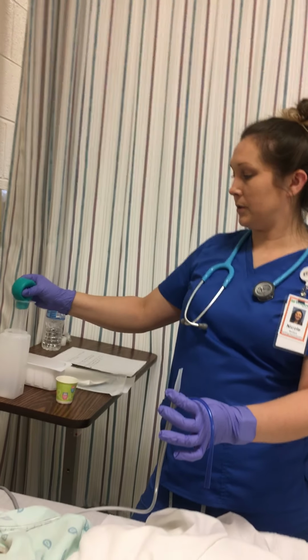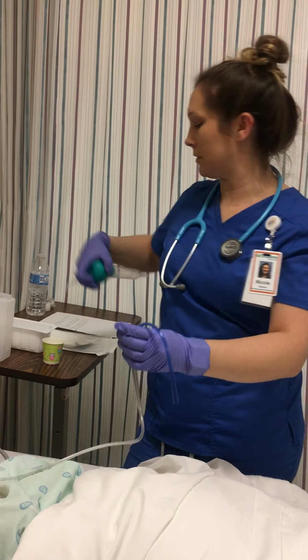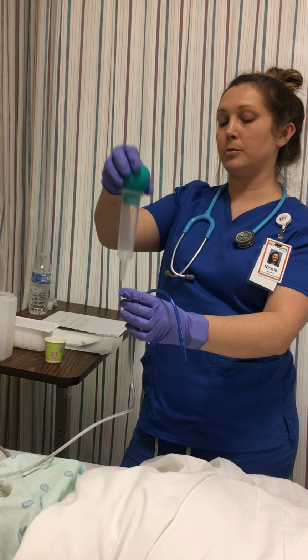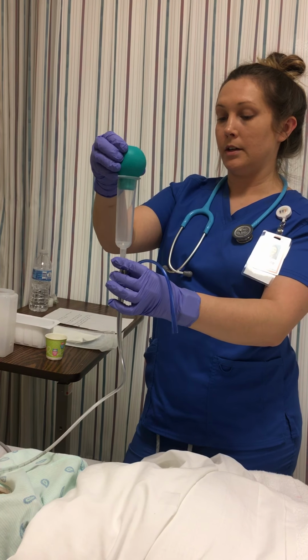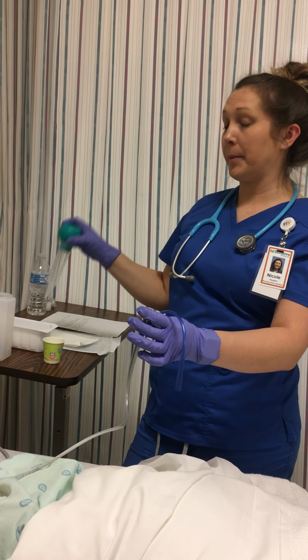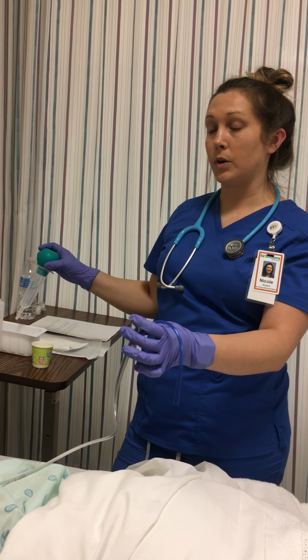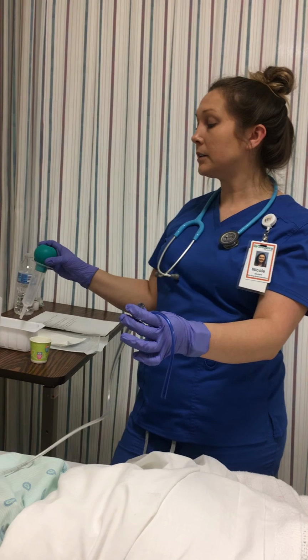So I'm going to administer my normal saline, and then I'm going to take it out and put it into this container. I'm going to do this until the fluid in here is a clear or light pink color.